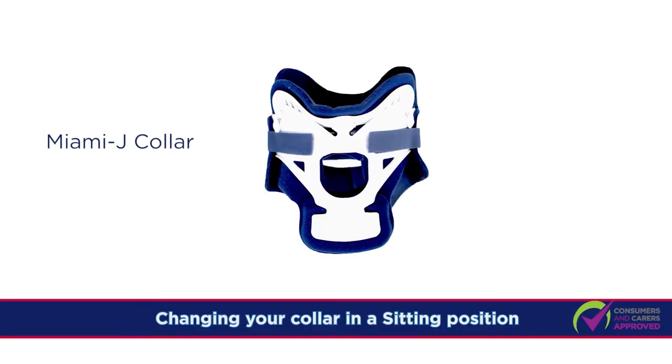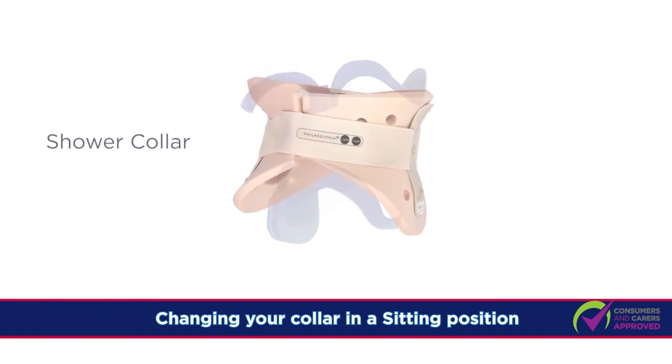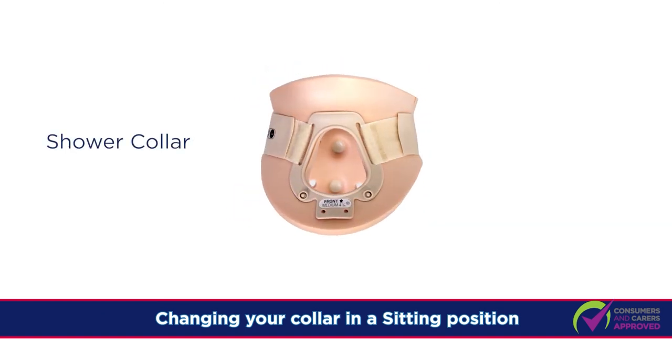This concludes the demonstration on how to change between a Miami J collar and a shower collar in a sitting position.